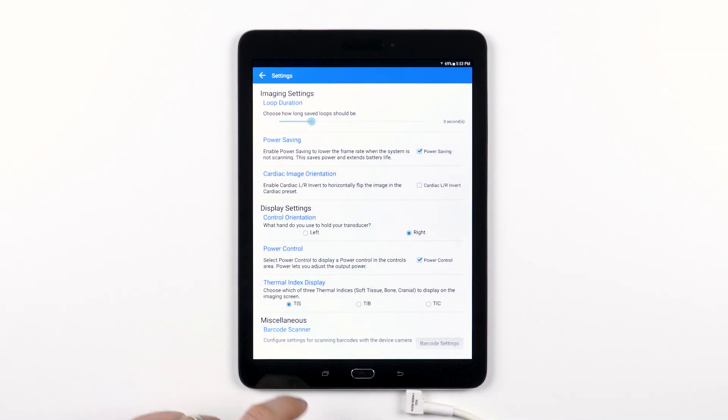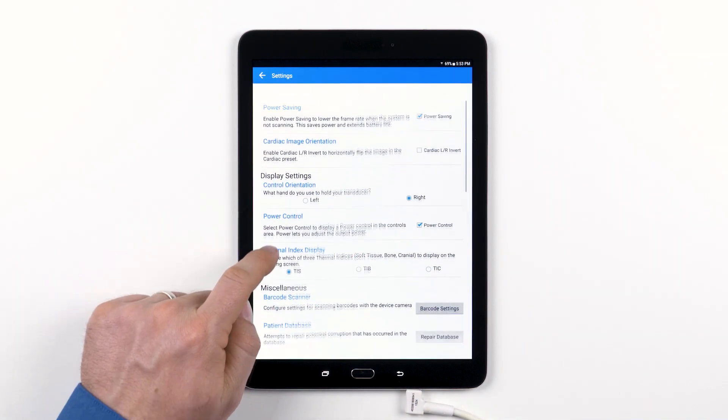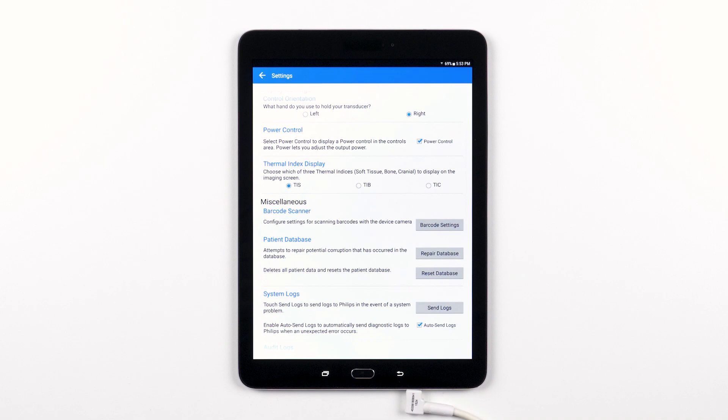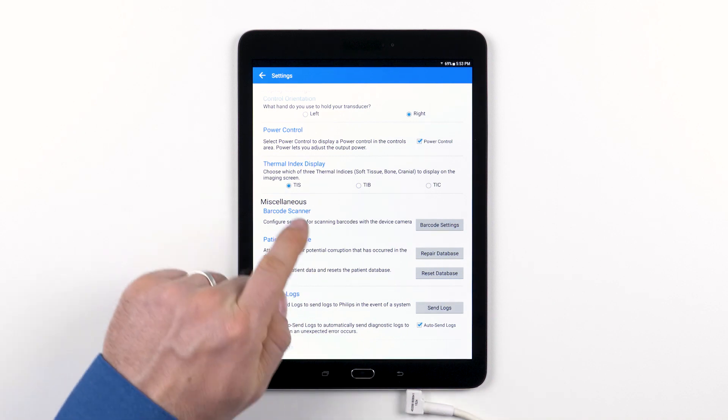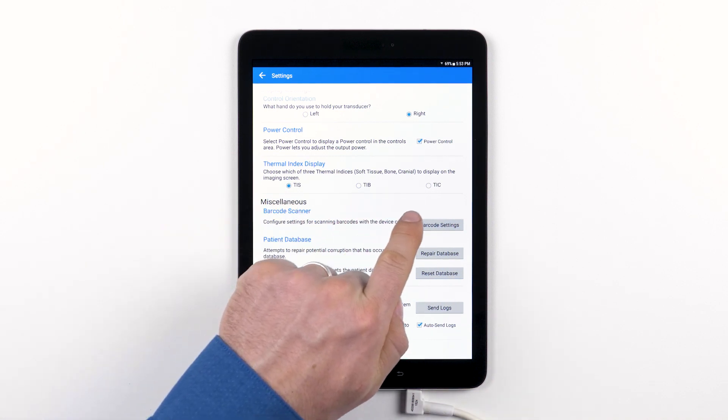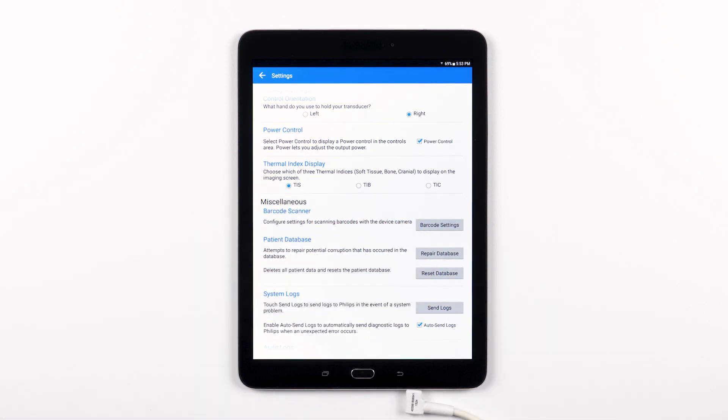Next is the thermal index display. You can choose which of the three thermal indices—soft tissue, bone, or cranial—to display on the imaging screen. Each clinical preset defaults to the most commonly correct setting, but if you wish to override this, we allow it in this control.